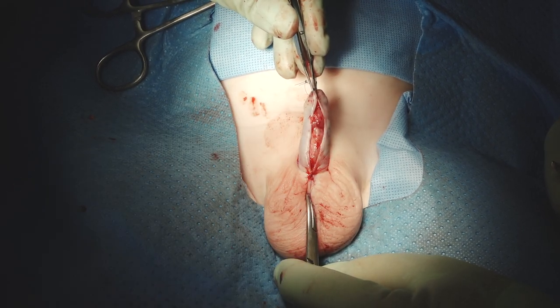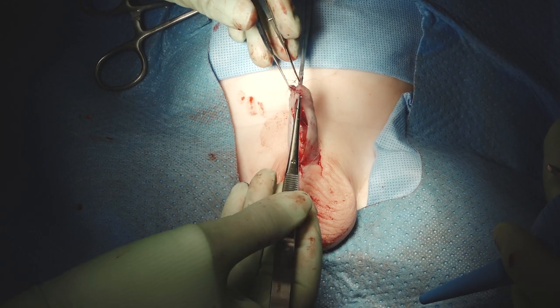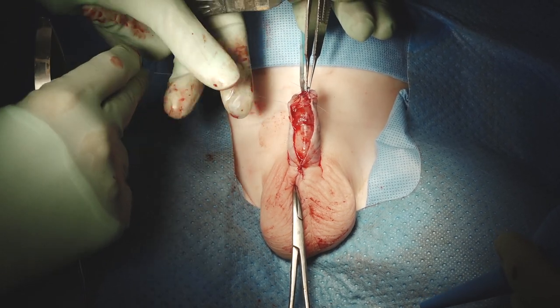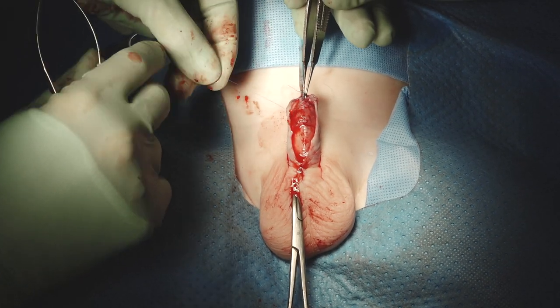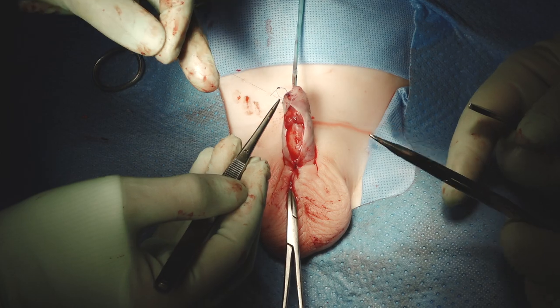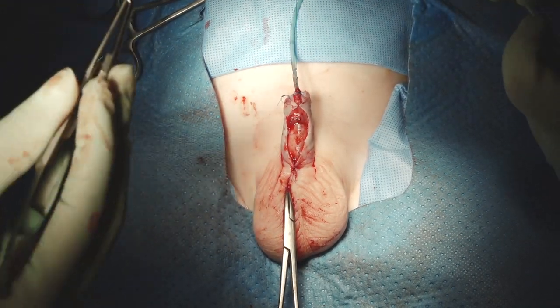So that now we're much more even in terms of our skin and we don't have any folds to worry about. I like to tack this quickly to be sure I like how everything is lining up, and then we're going to zip up our skin from the bottom up, then finally turn it to the dorsal surface. That has really made it so we don't tend to have the skin shortages people talk about — because we adjust for it before we make any cuts.